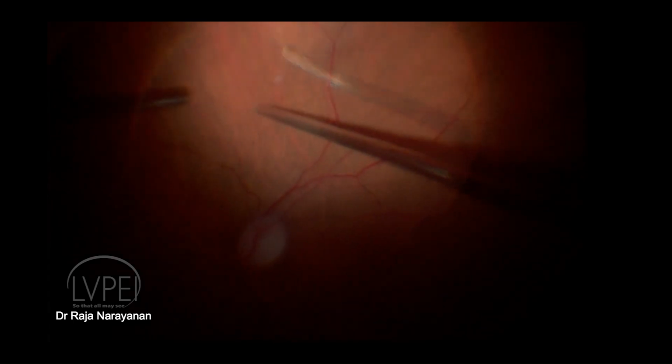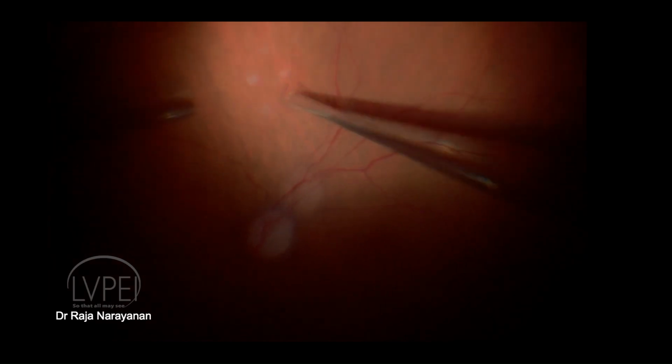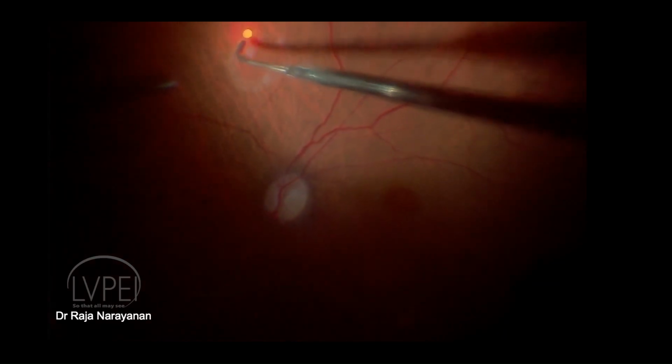We first checked for the dislocated graft, which was discovered in the infratemporal vitreous base. As we can see, the graft is now white, opaque, and undergoing ischemic necrosis. A new donor site was chosen infranasal to the optic disc, and an appropriate graft site was checked by diathermy.